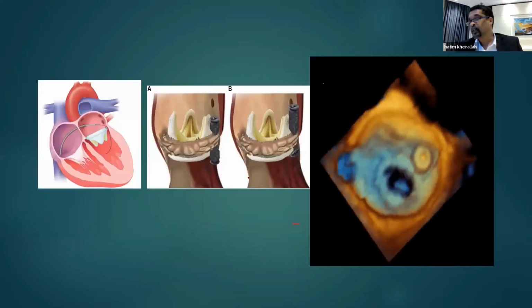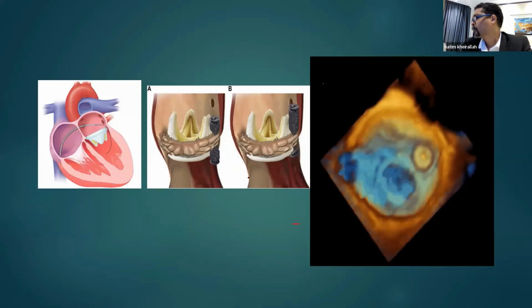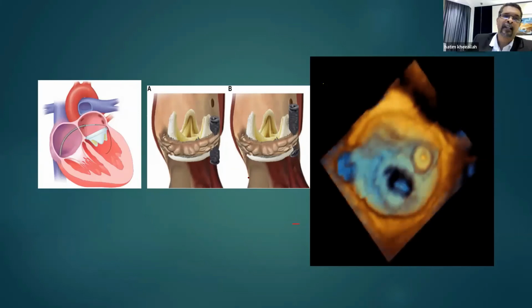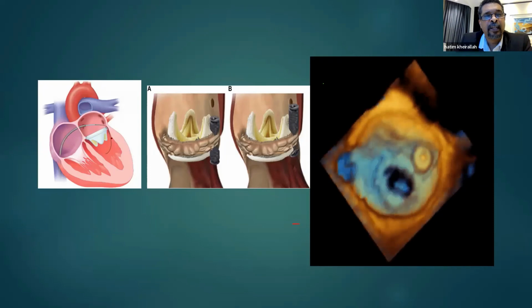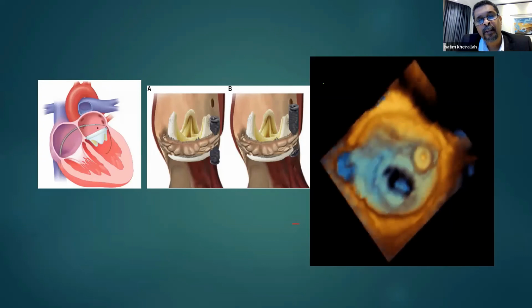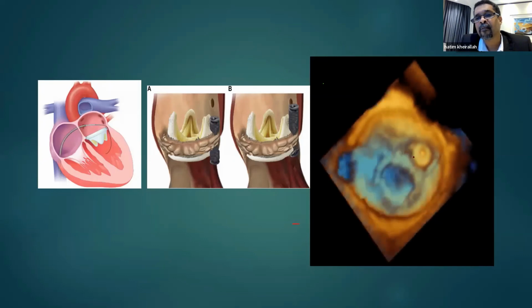Now, what is this procedure? This is an occluder for leakage, also paravalvular leak. Exactly. Yes, very good. This is the plug, which is an implanted device. Again, this is a percutaneous intervention. Like here, if it's a mitral valve, they go through the septum and see where they pass their wire, where the leak is, and they put something that looks like an implant there to close the defects. In this case, it was the mitral valve here.